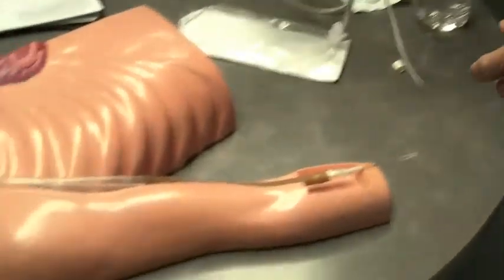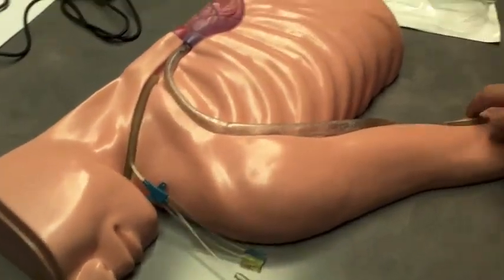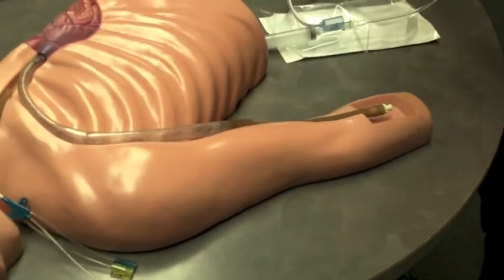No more blood pressure cuffs, EKGs, or pulse oximeters — it's all handled just by putting the catheter inside the IV tubing.